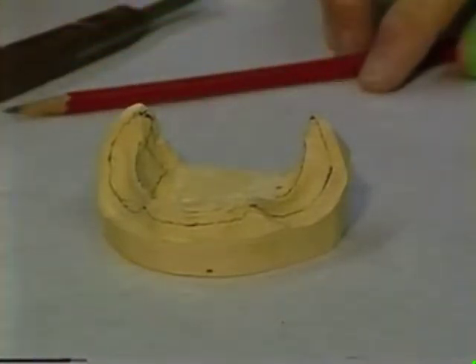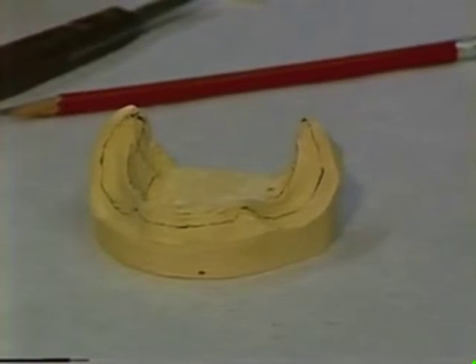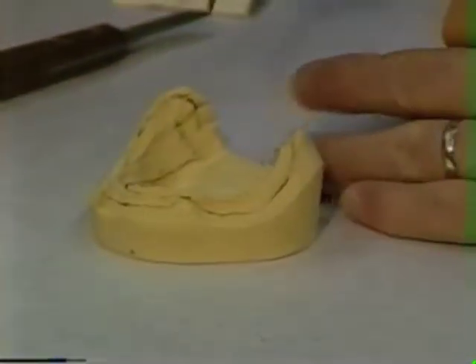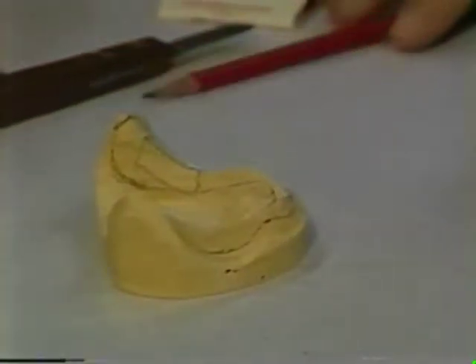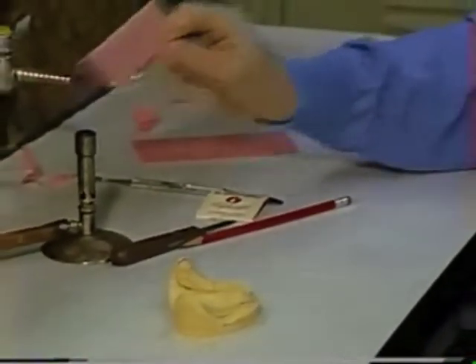So we're going to start the application of the relief wax then by cutting some little squares of wax. Now that was neat, wasn't it? To fit this area and this area and get those adapted first. We just heat some wax up in the flame again for that.